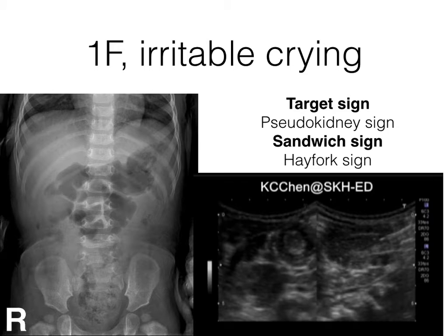Like this one. But actually, you cannot diagnose intussusception based on radiography. So myself, I do not take the X-ray, because it is nonsense. But if I'm trying to look for others, such as bowel obstruction or free air, I will take the X-ray for that kind of purpose. Here are names you can remember to describe the sonographic signs of intussusception.